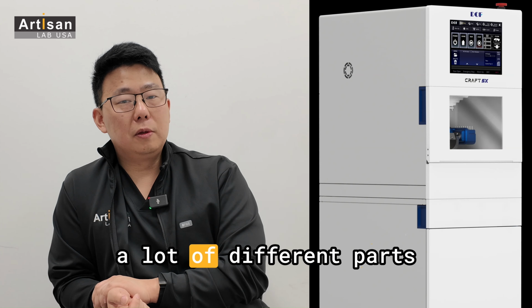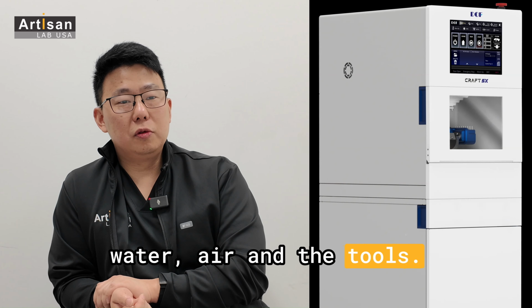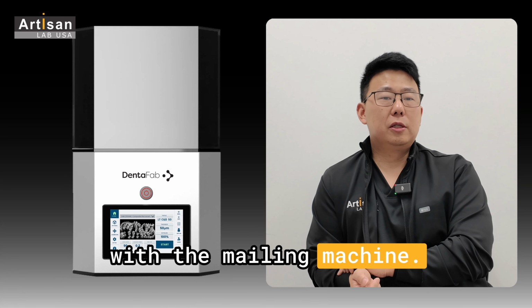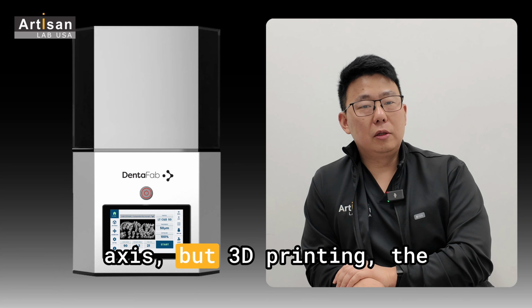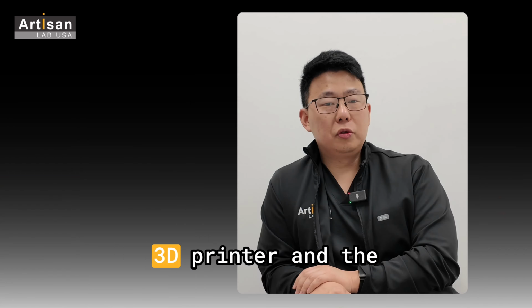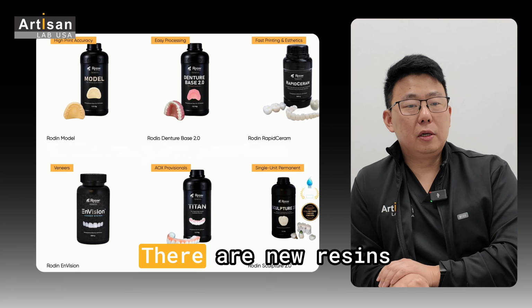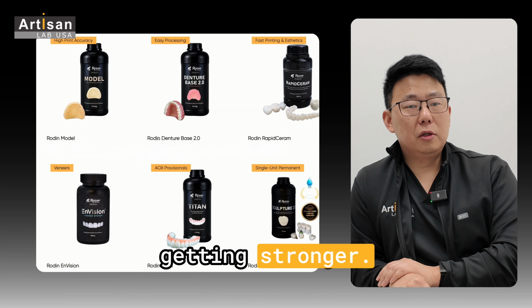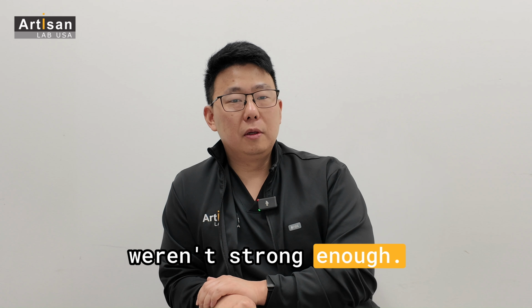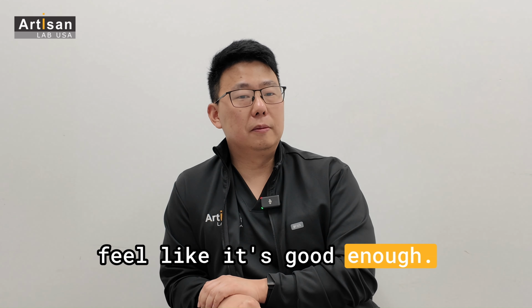And you have to think about a lot of different parts, such as the air compressor, water, air, and the tools. But with the 3D printer, there are not many moving parts. With the milling machine, there are 5 different axes. But with 3D printing, the cost is lower, it's faster, and it's a lot simpler to use. 3D printers and resins are still getting better. Every year there are new, stronger resins. A few years ago, I would say the 3D printed temporaries weren't strong enough. But now a lot of people are using them and feel they're good enough.